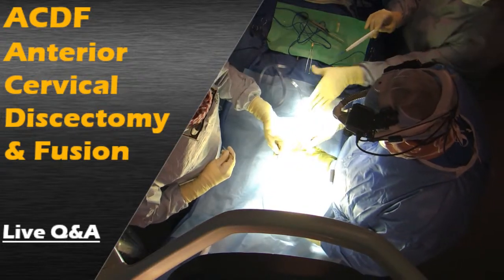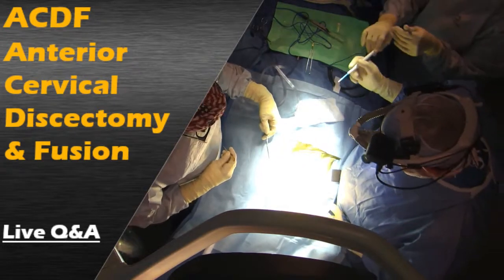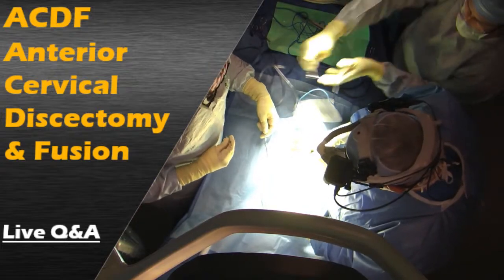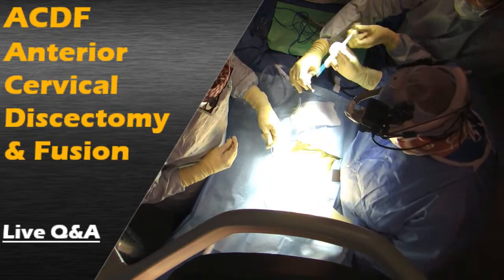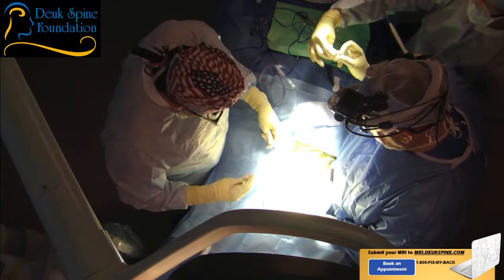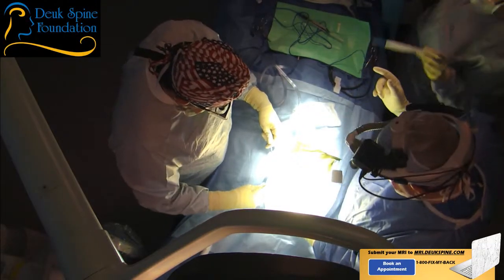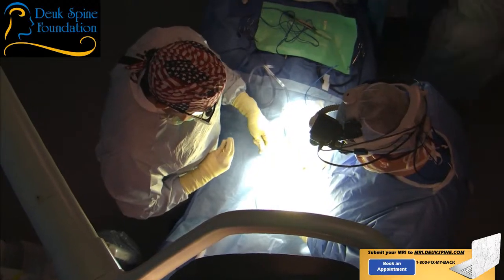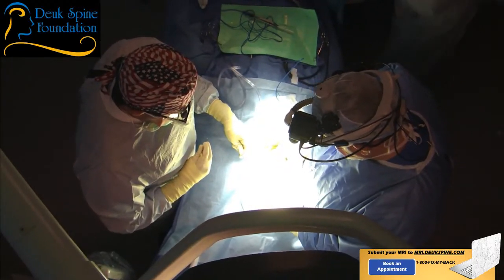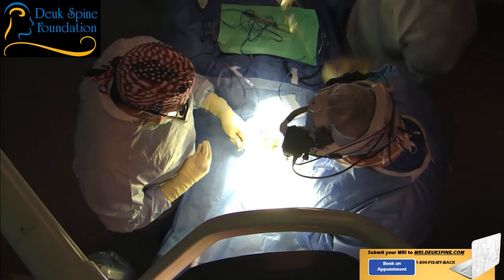How's the blood pressure? The last one is around 100. Okay, perfect. All right, let me have the Bovie. Yes, sir. So we've cut through the skin and the subcutaneous tissues using a Bovie coagulator.